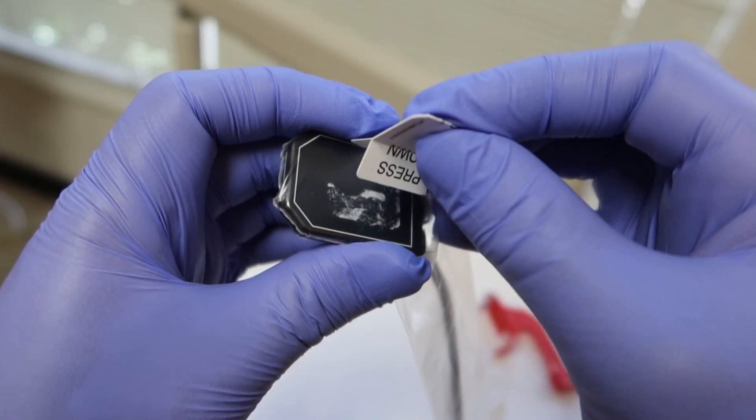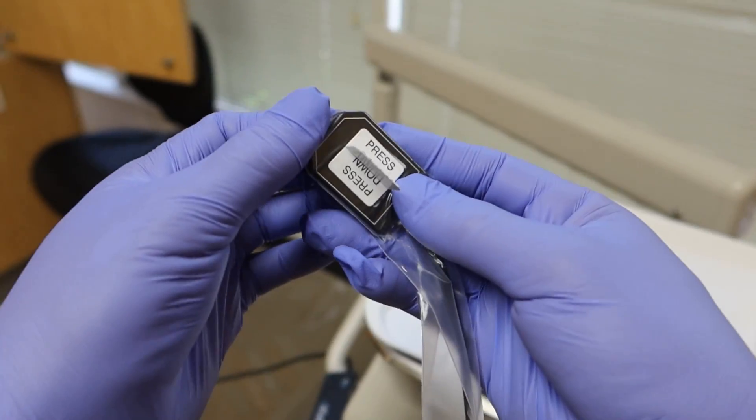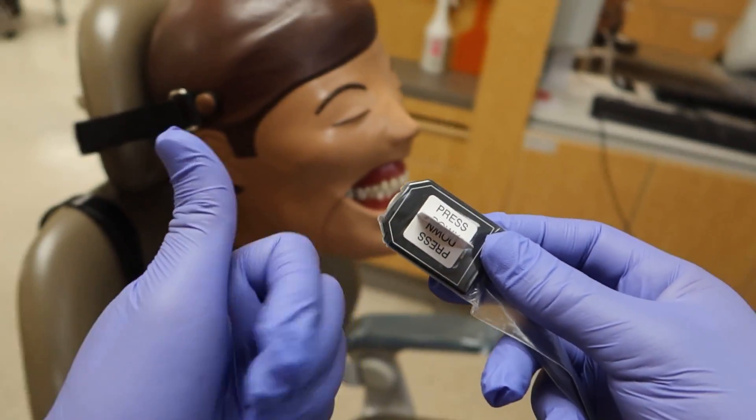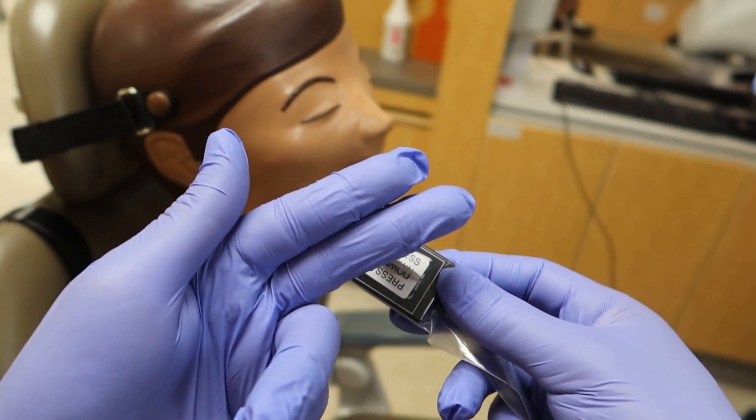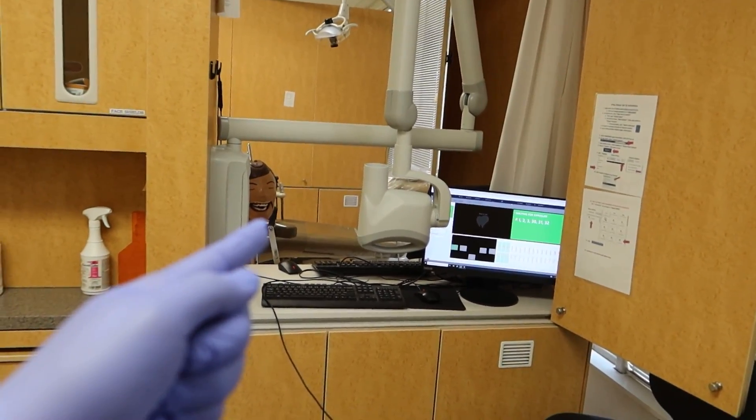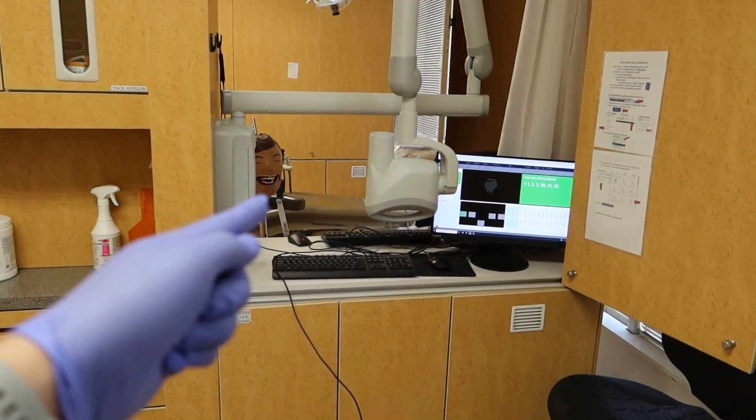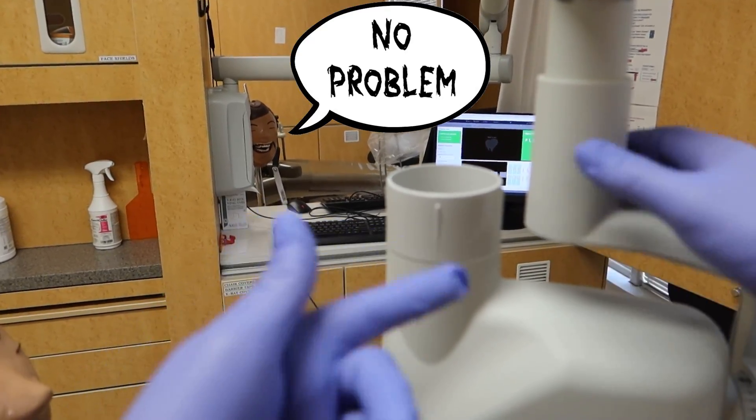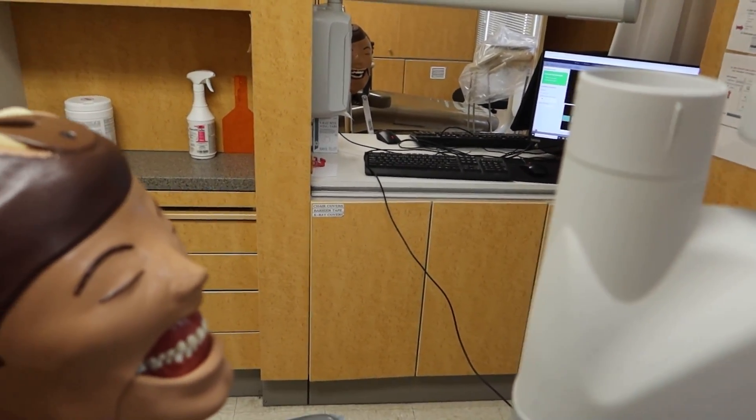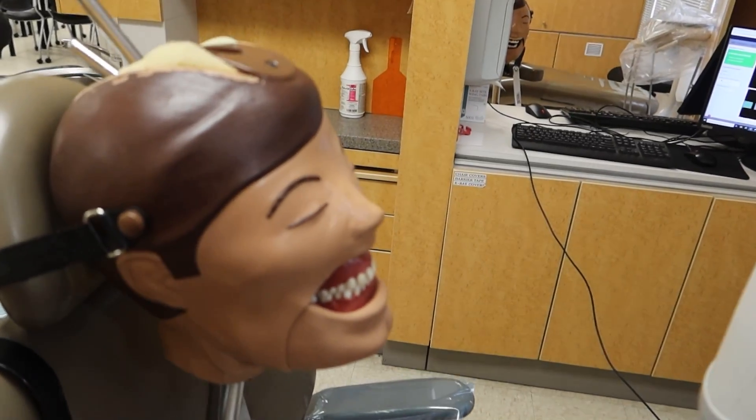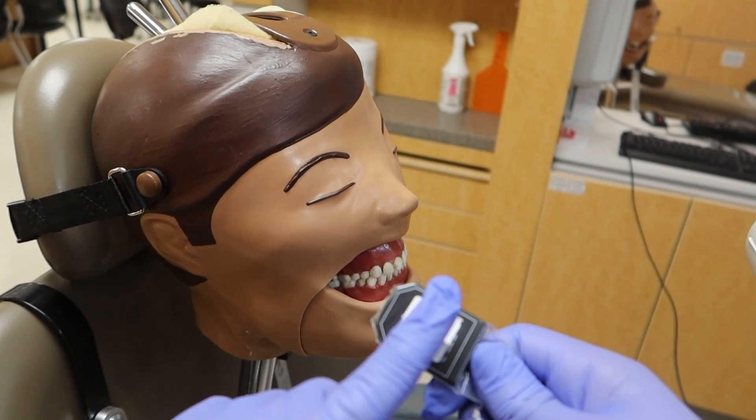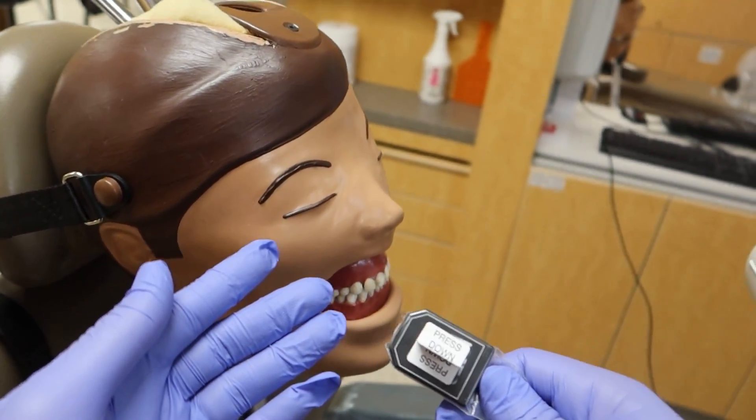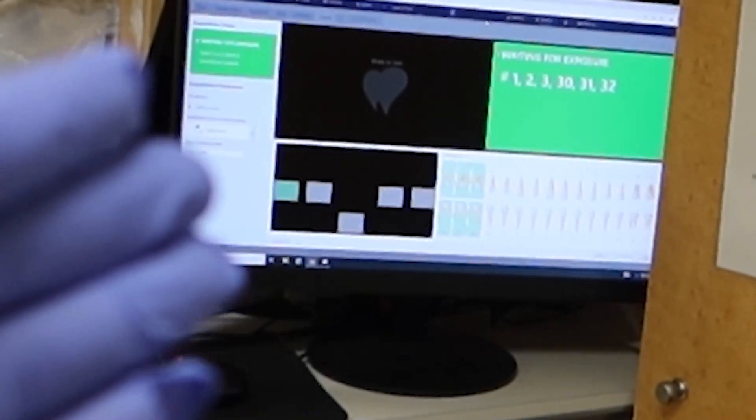First set I'm going to take over here on this x-ray is going to be with my little tabs. And with that, now I can go ahead and take this to the patient's mouth. But because Quinn's right here raring to go, I need to make sure that I'm raring to go with my actual x-ray tube, which is all the way over there with that guy. Hey, I told you I'll be with you in a moment, but can you kind of push that over here to me? Thanks, bud. Now I can go ahead and have this nearby so I can just go and aim it right at my patient as I need to. With that, when taking your sensor to the mouth, you always want to make sure you have a visual and know-how of where you're going to be placing this and where you're going to be taking an x-ray of. My setup over there is telling me to take a molar shot as indicated by the green square in the molar position.